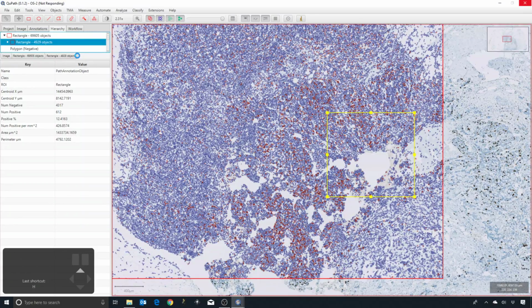It does normally get there. It's a question of whether or not you have the patience to do it. And that's the reason why in the next release of QuPath, you will have the option to not necessarily show all of the cells within this hierarchy, because then the performance overall in the application can be a lot better, because this one little hierarchy component can cause quite a bit of trouble and can be a little bit infuriating.